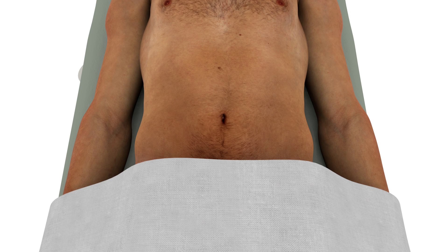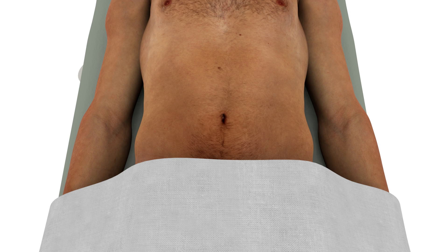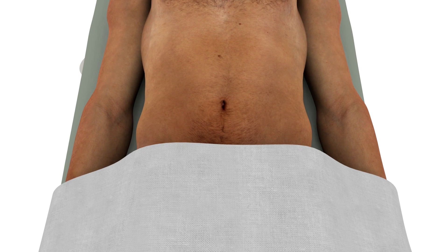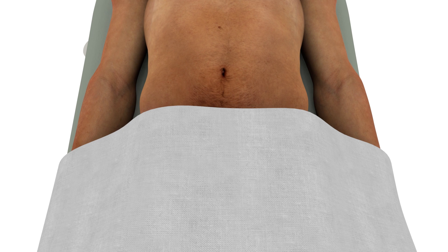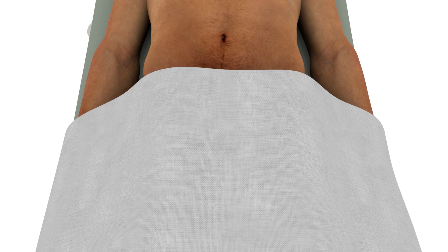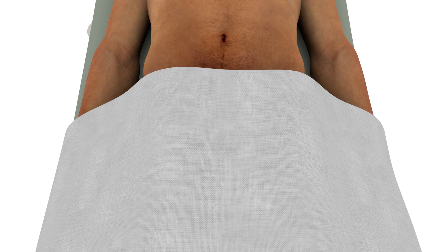Views should be obtained with the patient in the supine position. Place a sheet to cover the patient below the level of the pubic symphysis.